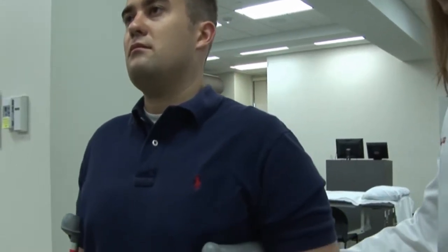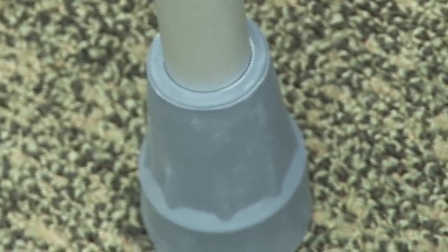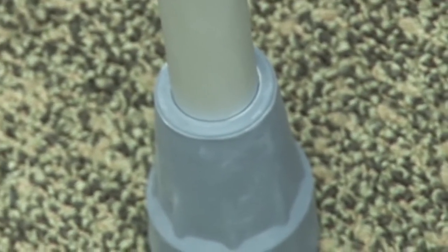Follow your doctor's instructions about the amount of weight allowed on your injured leg, and periodically check your crutch tips for wear, rocks, or ice to prevent them from slipping on different types of surfaces.